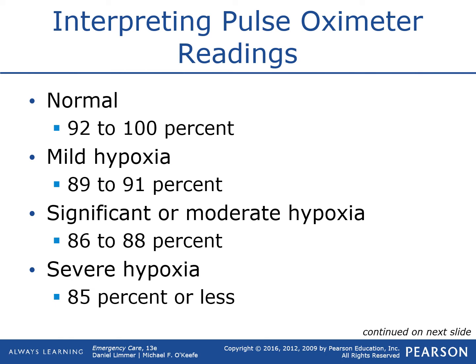And also, if your SpO2 monitor is reading 80%, but your patient is sitting up there talking to you just normally, complaining of toe pain, take that into account. A patient with a true SpO2 below 84% will probably not be presenting normally to you. So that means that your reading might not be accurate. These readings are very often not accurate.